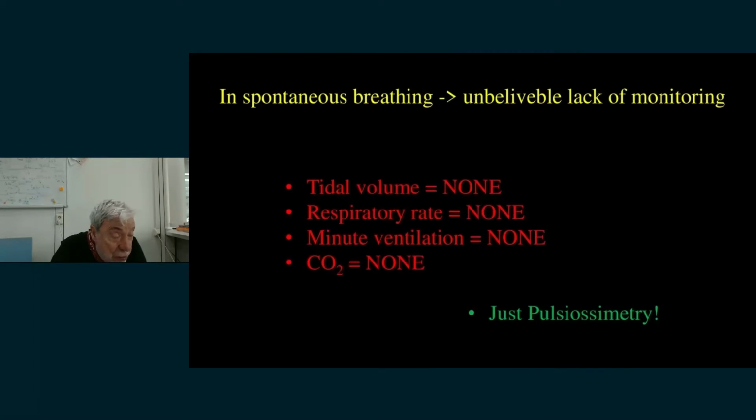We do not record the respiratory rate, unless you go there, but this happens very rarely. Not having tidal volume and respiratory rate, you don't have minute ventilation, and you have no information about end-tidal CO2. We have just a pulse oximeter. And look at the patients.